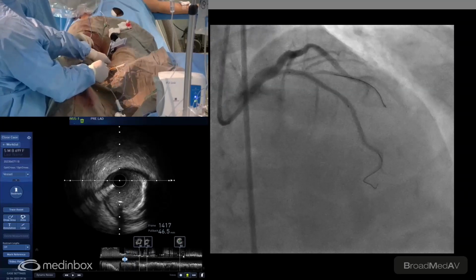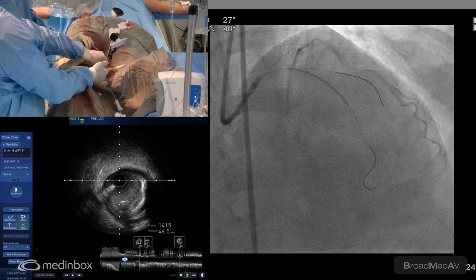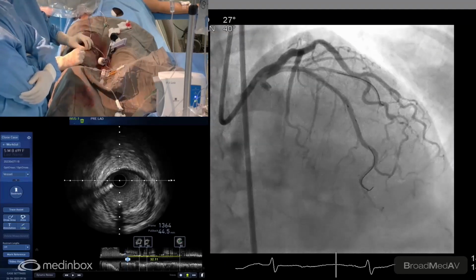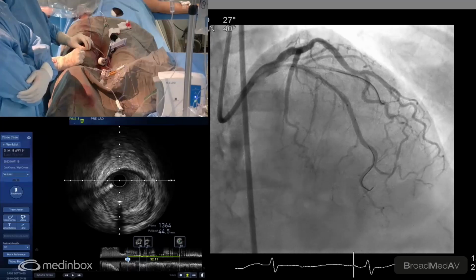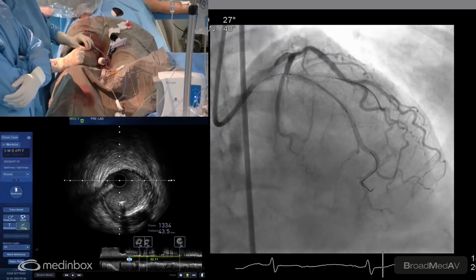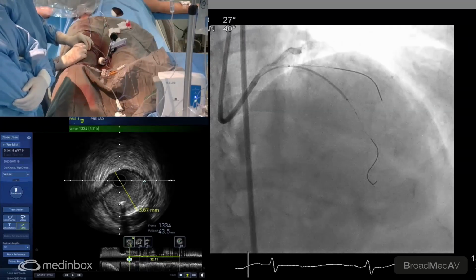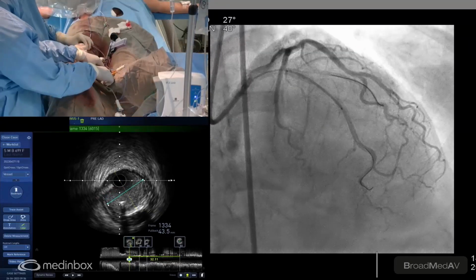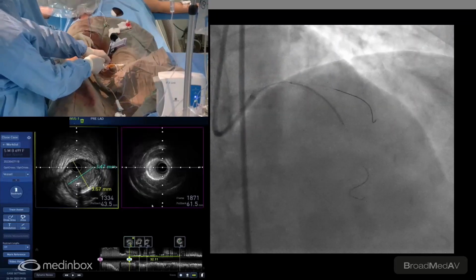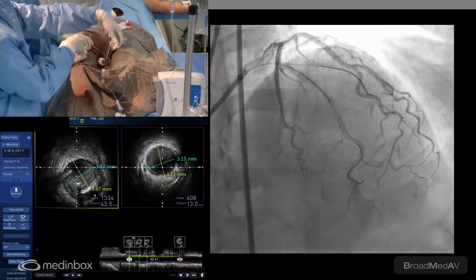Small check. So that looks good, we may take a cine. I think we have covered the proximal lesion and the distal. What do you think, Ashish? Yes, sir. We noticed in the imaging as well that between the two diagonals, the proximal normal segment was about 4 millimeters. So exactly, I think the stent has moved back a millimeter. Yeah, it's moved in. The stent has moved in.